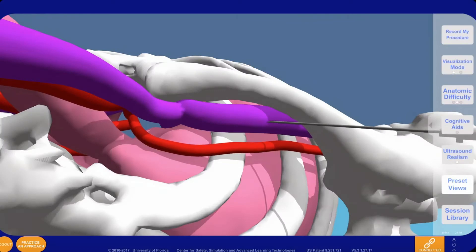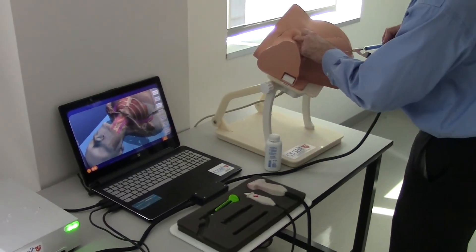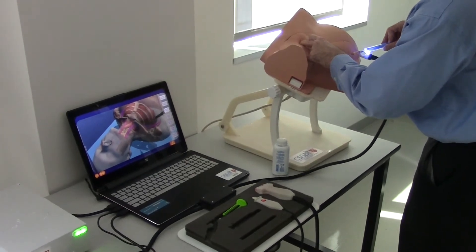Flashback is simulated using lights, blue for venous blood and red signifying arterial blood. Flashback occurs only if the plunger is pulled.